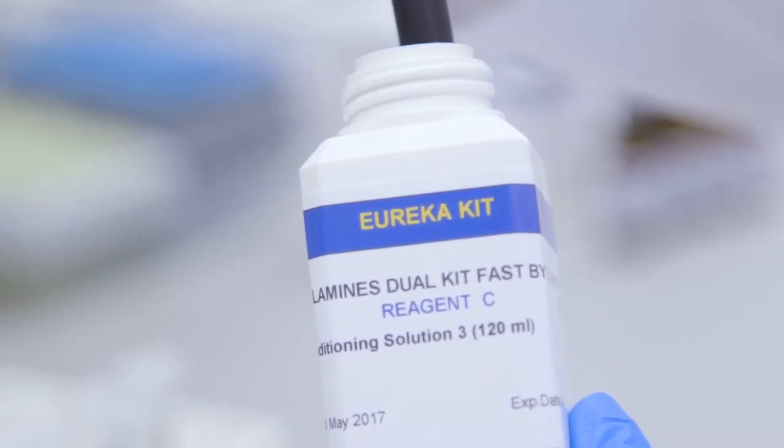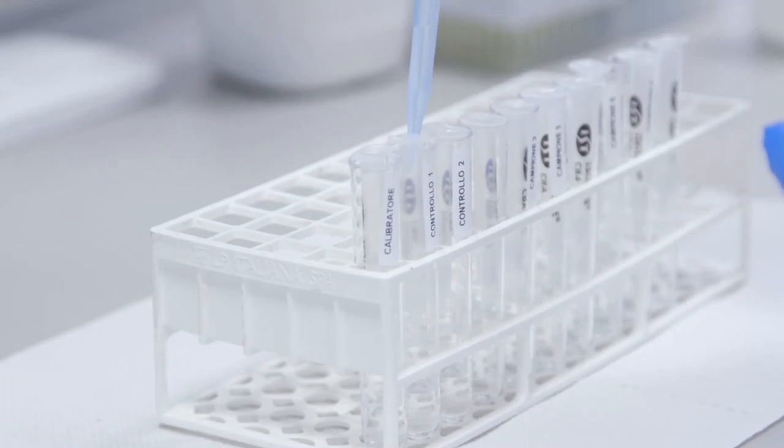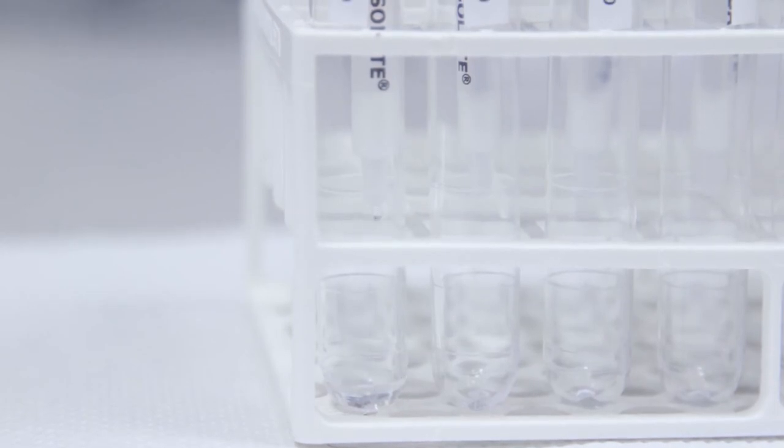Finally pour one milliliter of reagent C conditioning solution one into the columns and let the solution flow through the column at a flow rate of one milliliter per minute drop by drop.